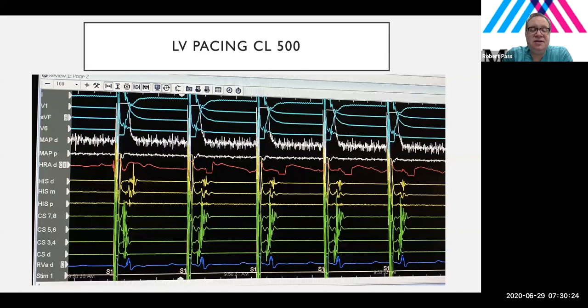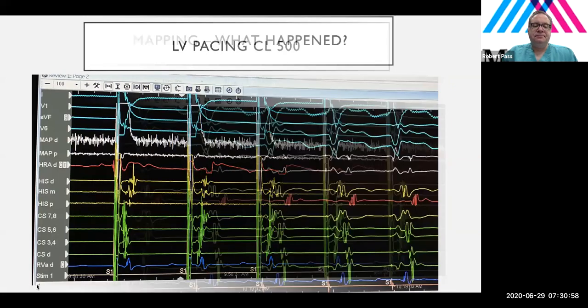And so Dr. Love, based on this, perked the artery and placed a quadrupolar catheter gently across the aortic valve into the left ventricle. And we were able to pace the ventricle at a slow rate, 100, 120 beats per minute, and map the accessory pathway. Because this demonstrated retrograde conduction via the accessory pathway, whereas right ventricular pacing would not do that. So that's an interesting little wrinkle in this case.